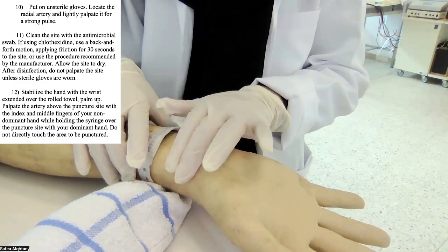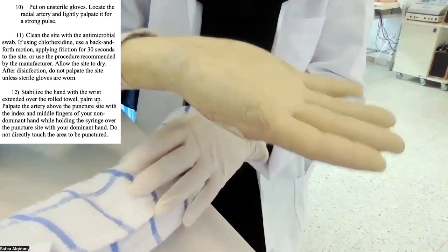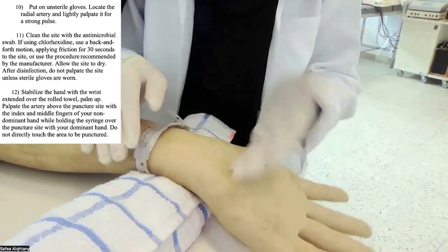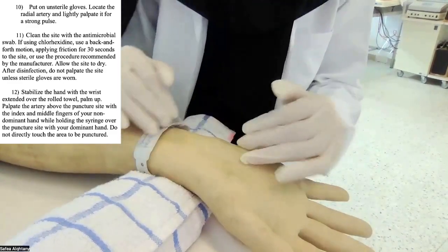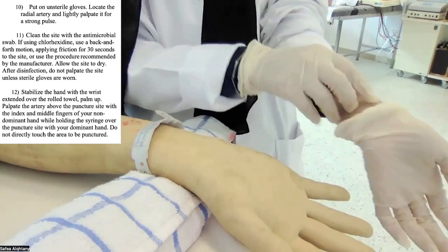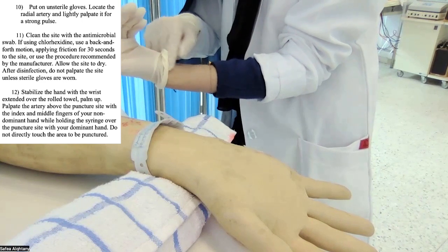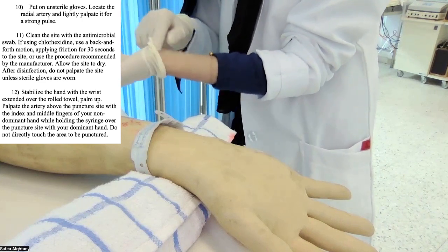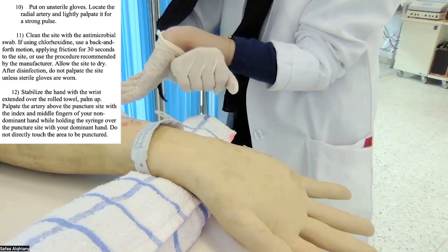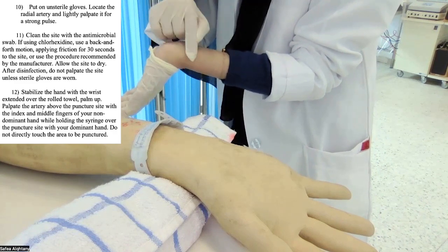Okay, and then if I found the pulse, that's fine. I need to place a rolled towel under the patient's wrist and extend his arm like this. يعني يكون بهذا الشكل. لأنه هذا البوزيشن راح يعطينا better access to the insertion site. For example, here if the patient is, for example, doing like this will be difficult for me to obtain the sample. But if the patient extend his wrist like this over a rolled towel, it will be easy to obtain the sample from the radial artery.